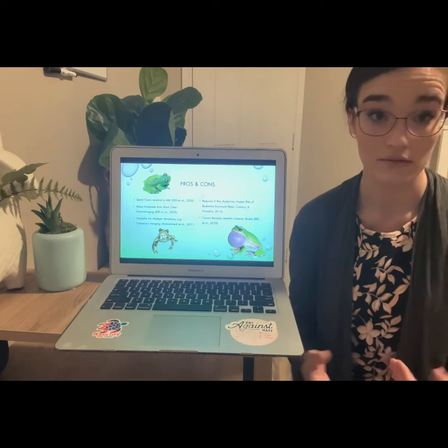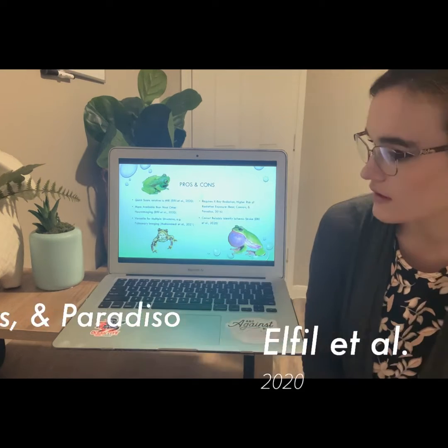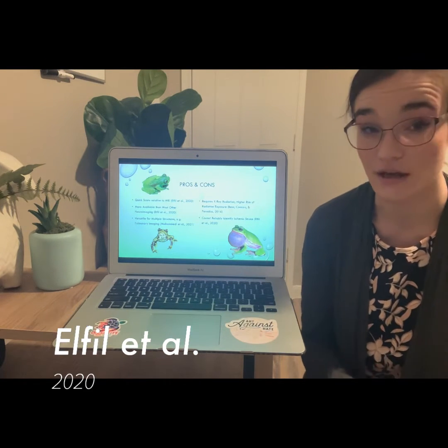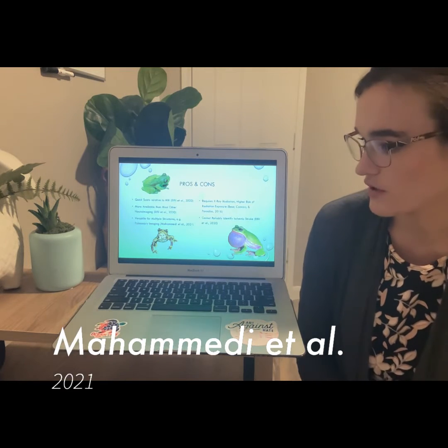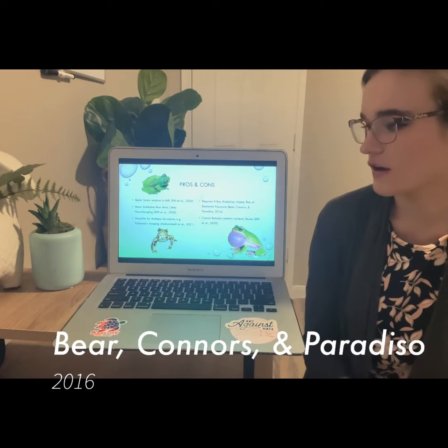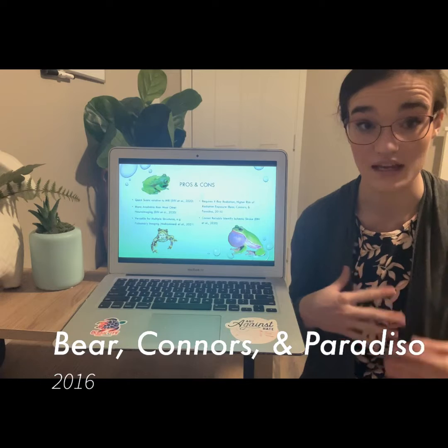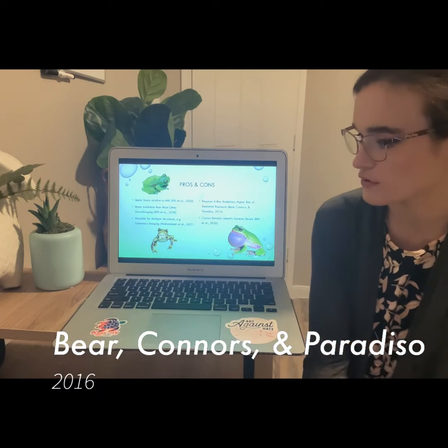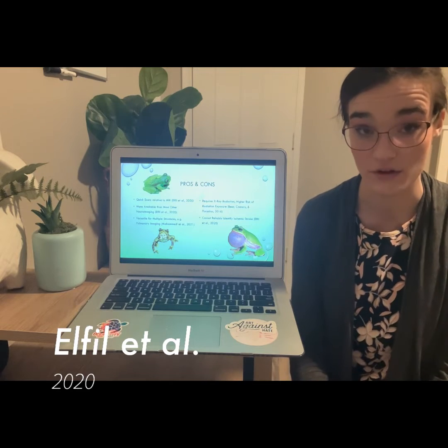So some benefits are that it has very quick scans relative to MRI. It is more available than most other neuroimaging techniques, and it is very versatile for multiple structures. For example, it's used in pulmonary imaging as well. Some cons are that it requires X-ray radiation and gives a higher risk of radiation exposure. And it cannot reliably identify ischemic stroke at this point in time.